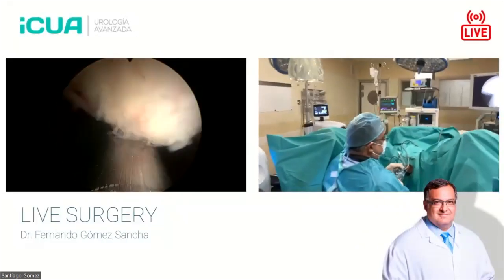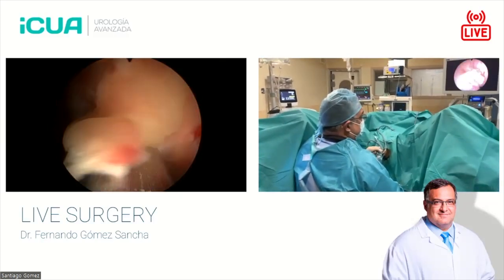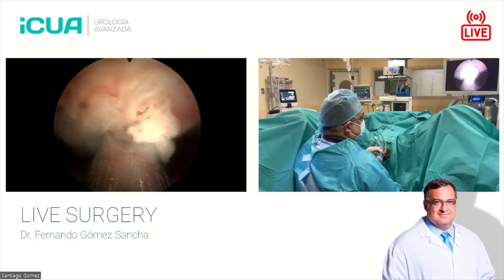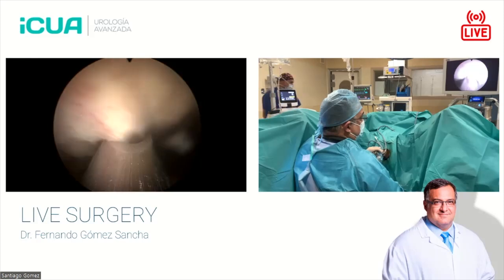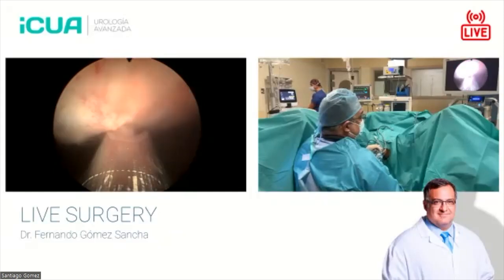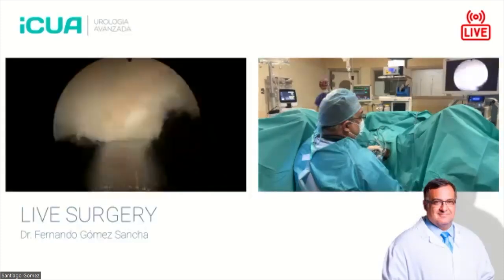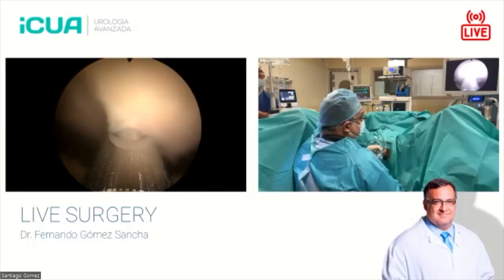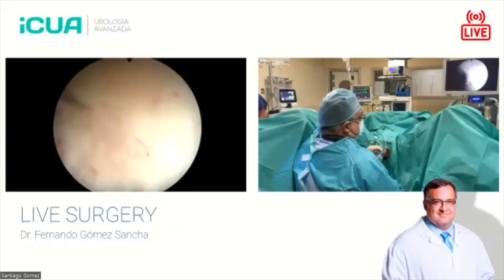Yeah, my impression is also that after TURP, the strictures of the bladder neck recurred very quickly. But after laser operation, when you incise it, like you mentioned with Mercedes Star, it will probably not appear again. It's surprisingly easy to solve. I remember in my life a couple of cases where the stricture recurred and recurred and recurred, but the frequency of strictures that will recur is very, very minimal.